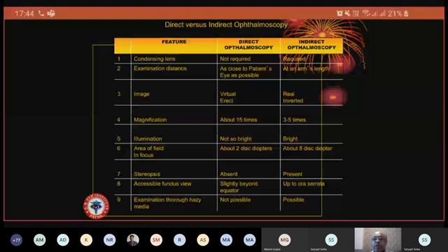Again, tricks or tips: compare with the other fovea, look at the blood vessels at the fovea, what we discussed yesterday, the foveal avascular zone, the size of it, that area over there. See if there is small wrinkling of vessels over there, see if there is any shiny reflex over there, and at those points, you can make out a taut posterior hyaloid membrane. I hope I've been able to explain myself.